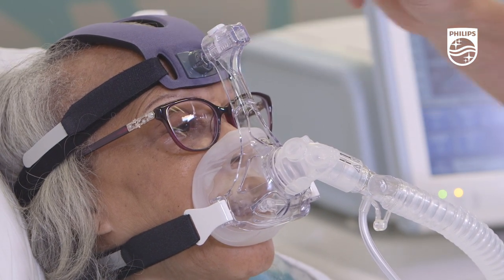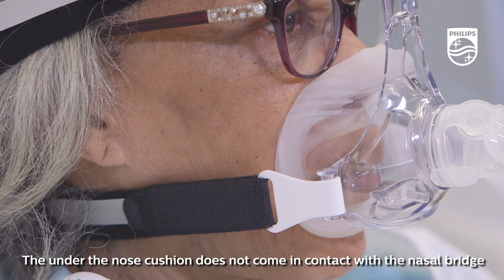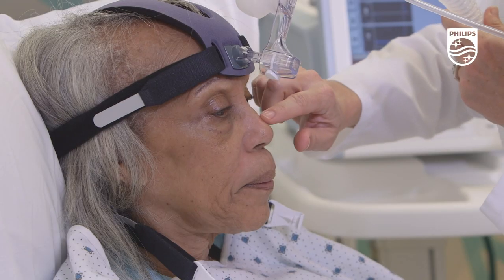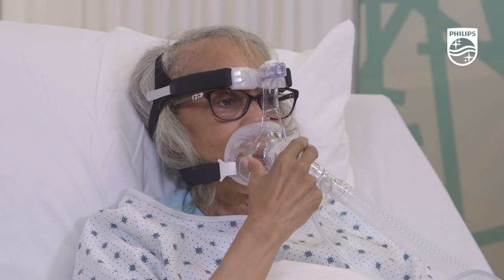The cushions are contoured in a way that helps provide extra support and comfort when the mask is in use. The under-the-nose cushion does not come in contact with the nasal bridge. Alternating the cushions on the AF541 mask offloads pressure points on the skin to better support your mask rotation strategies.